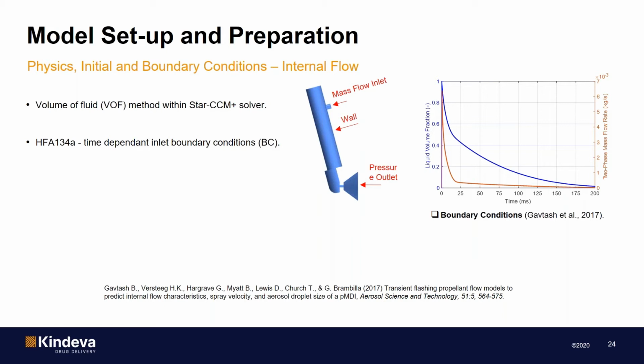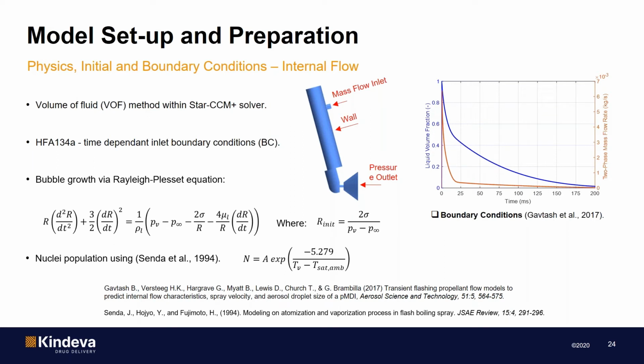Now the flow leaves the computational domain through the exit cone of the actuator nozzle where the pressure is taken to be atmospheric, i.e. 1 bar, and the flow in this modeling involves vapor and liquid phases, so it is necessary to use multiphase flow capability. And we have chosen volume of fluid mainly because this algorithm has the important capability to represent flash evaporation.